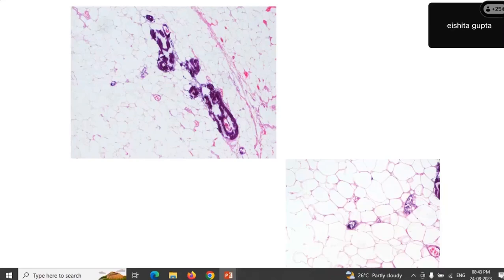Do we have anyone who's typing in the diagnosis? Variable opinion: fat necrosis, calciphylaxis, mycetoma, pancreatitis, eschar, calcification around fat. Calciphylaxis is by many people. Okay, so I think whoever's called it calciphylaxis ought to pat themselves on the back. So yes, it is indeed calciphylaxis.